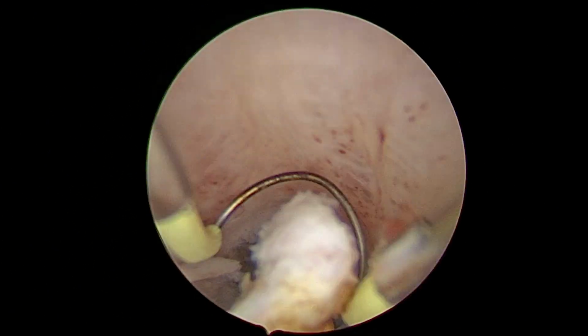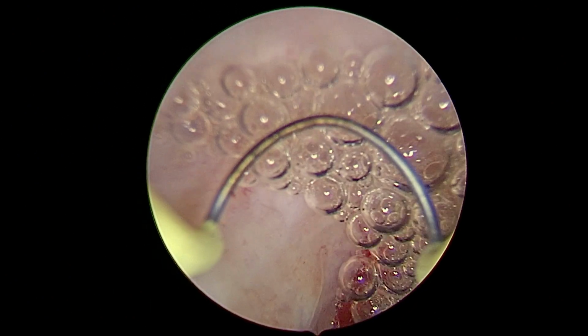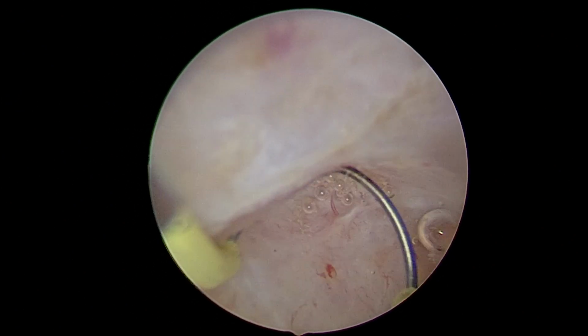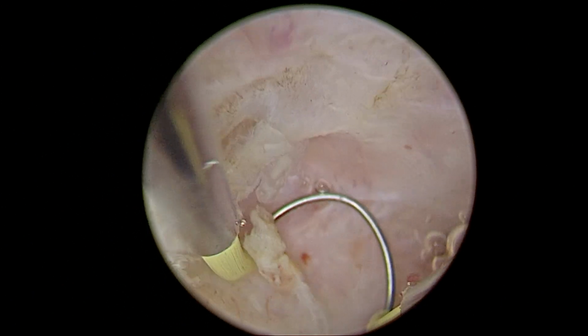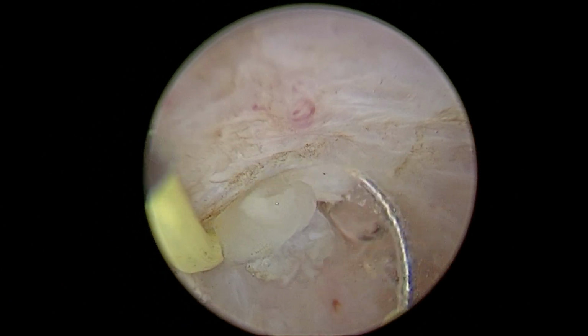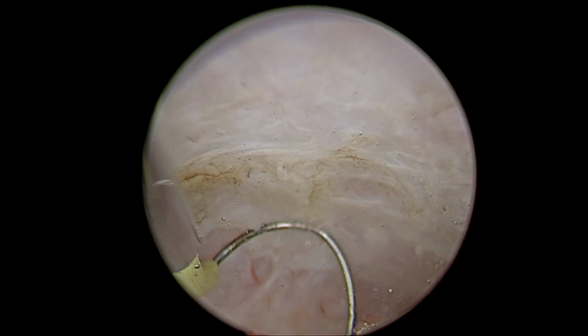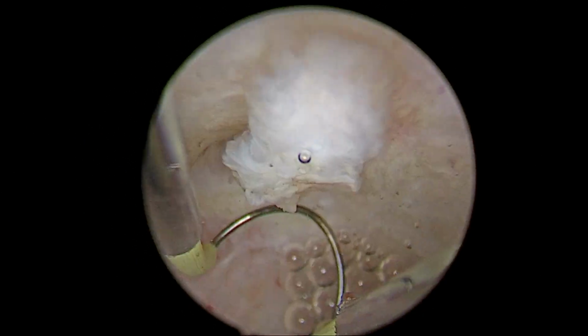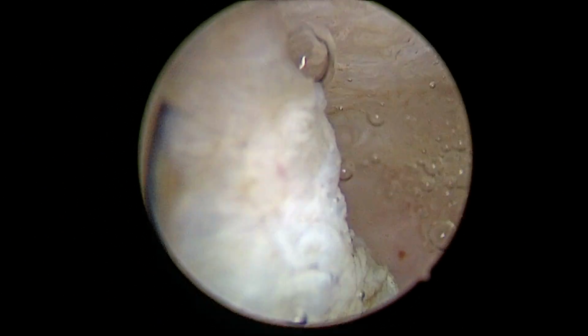So here what we intend to do in this surgery is to make the slope between the isthmocele and the adjacent cervical tissue, cervical canal, more soft, less angulated, and the base of the isthmocele, as you can see here in this video, is being resected so that the fluid which is getting collected here, the blood which is collected here in this base, you can see here it is deep inside, so this slope is being made soft so that the fluid stops getting collected here and comes out of the cervix easily, and that will help in no collection of blood in this part of isthmocele.